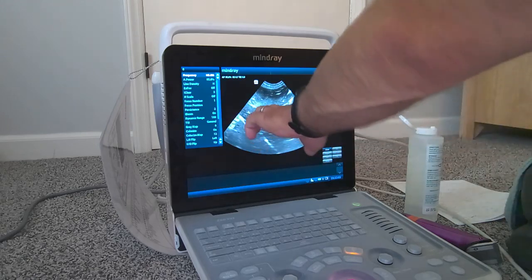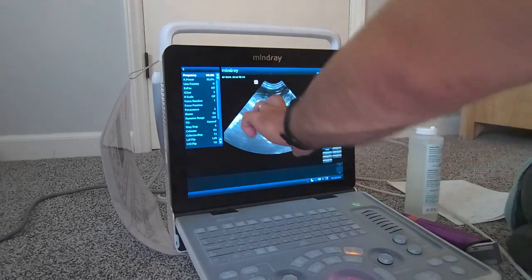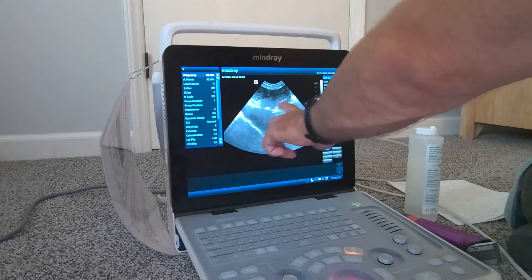So we've got spleen. Right now, looking at the two, you can tell the difference between these two organs, especially as they're sitting right next to each other. I'm going to adjust my focal point a little bit to right here on that interface between the spleen and the liver. So you see the spleen in the near field, sitting right here.